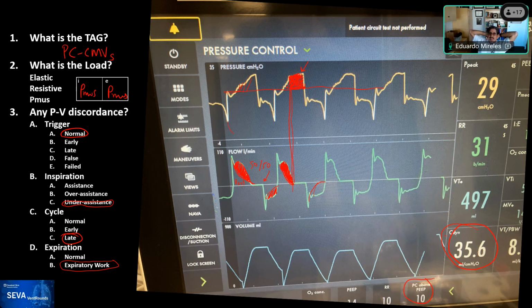So Ariel is asking, how do you fix this? And there are several ways to fix this. Anybody wants to put there? Ariel already suggested to shorten the I time. That's one. Any other?